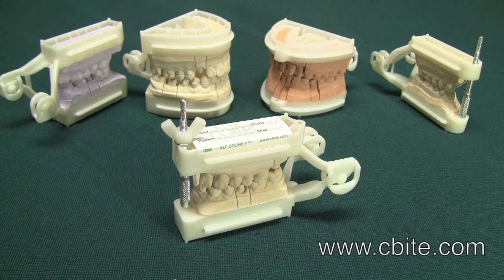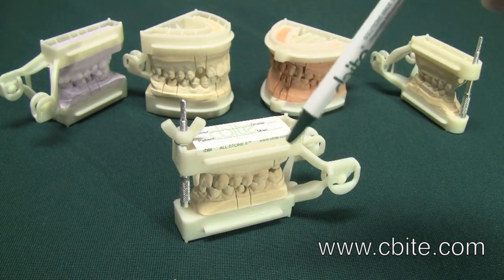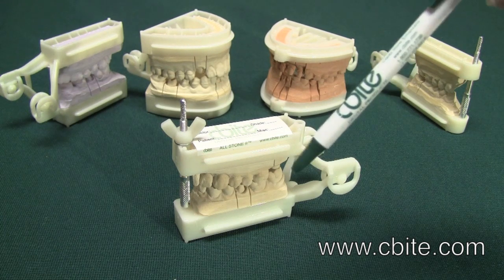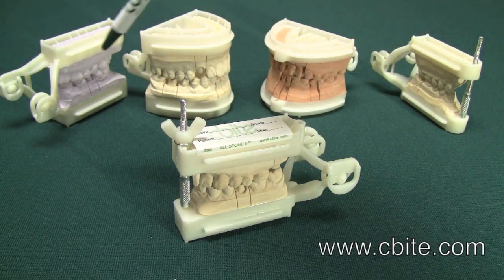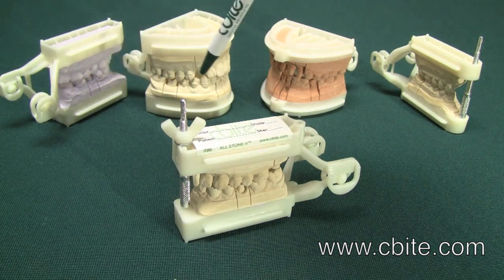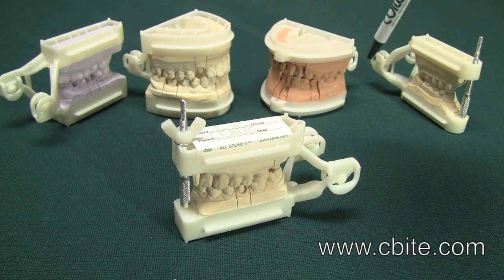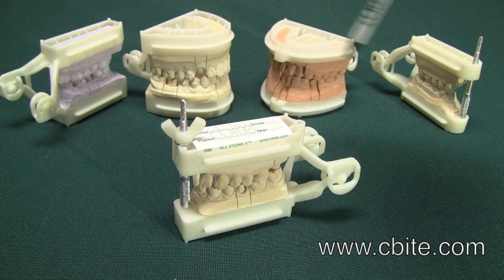This video illustrates the evolution of the Allstone Neo Articulator. The Allstone Neo was introduced in 2011. To my left is the original Allstone Quad and Full Arch, which we introduced in 2001. To my right is the Allstone 2 Quad and Full Arch, which we introduced in 2003.